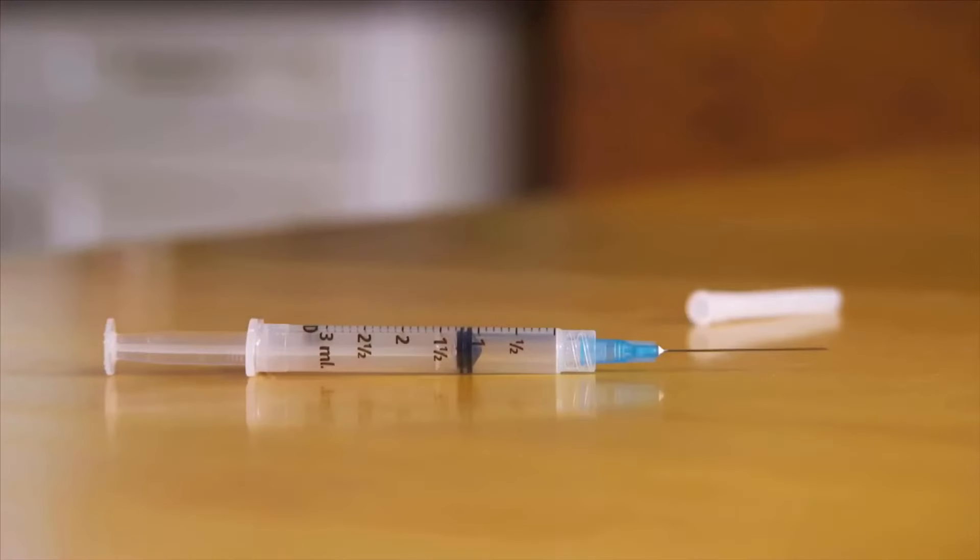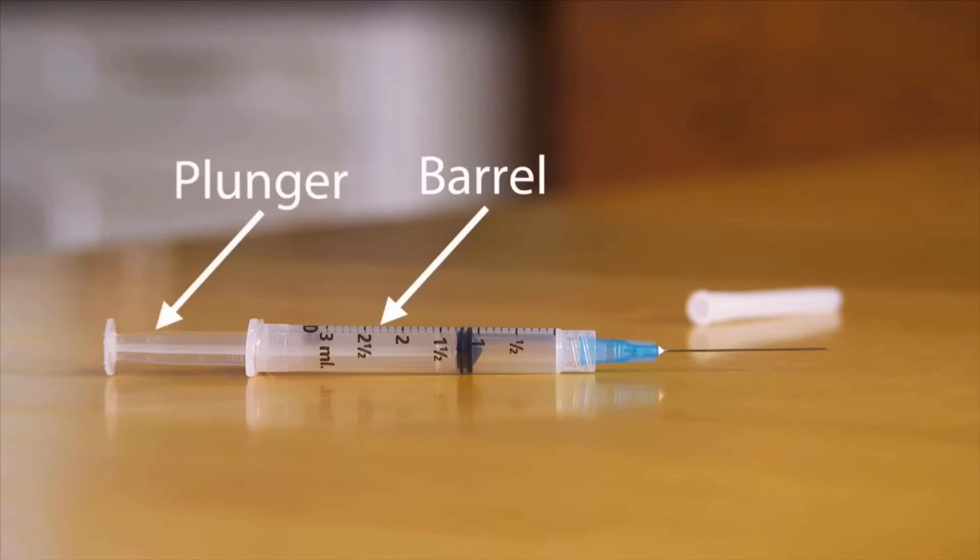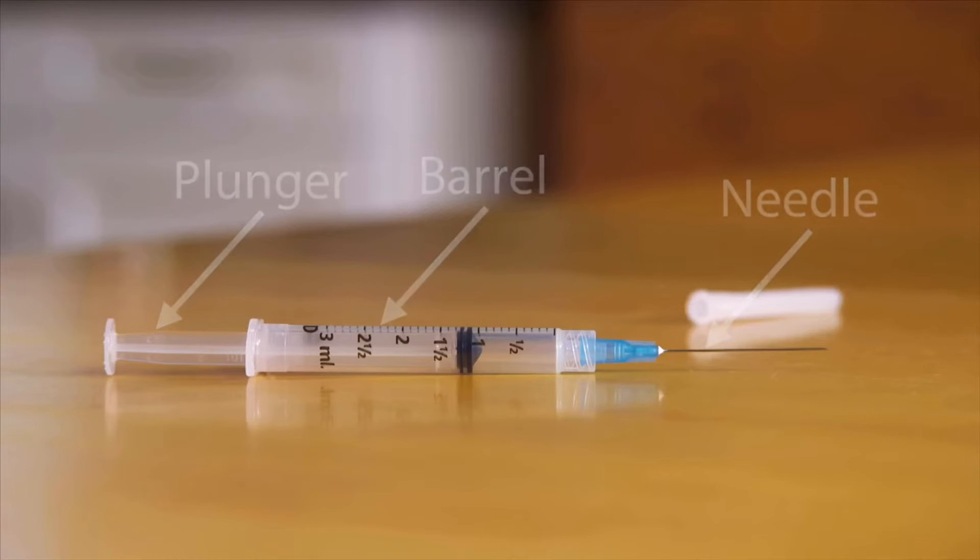The syringe is made of three basic parts: a barrel, a plunger, and a needle. The barrel has markings on the side. These help you measure the correct dose. Syringes come in different sizes. Your doctor or pharmacist will help make sure you know how to use the markings for any syringe you have.